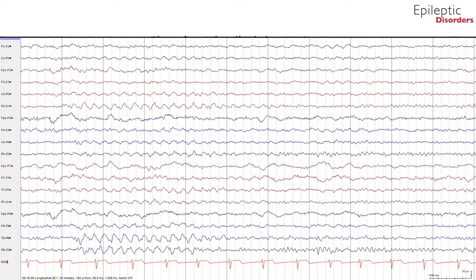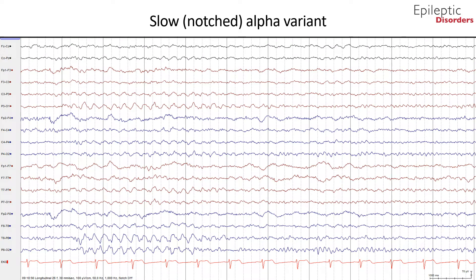In this bipolar montage EEG, we will discuss slow notched alpha variant. At times, harmonics or subharmonics of the background rhythm are seen. When this occurs, the resultant appearance is of a rhythm that is twice as fast or half as fast as the awake background. A slow alpha variant has an apparent frequency that is about half that of the awake background. These harmonics will often have a notched appearance as if many of the waves are simply being cut in half. This alpha variant is reactive to eye opening and closure.